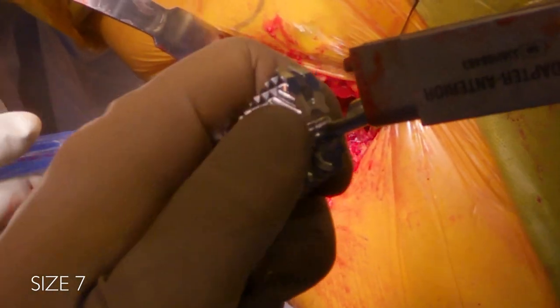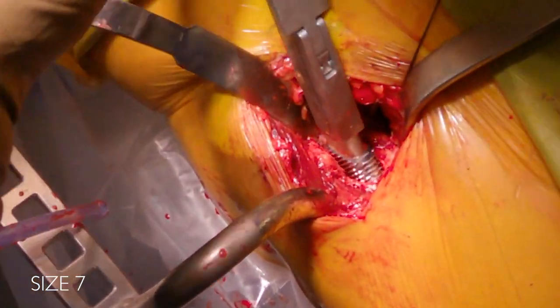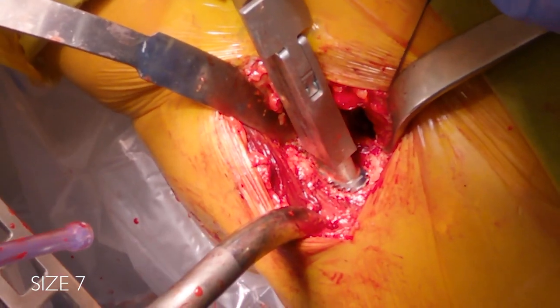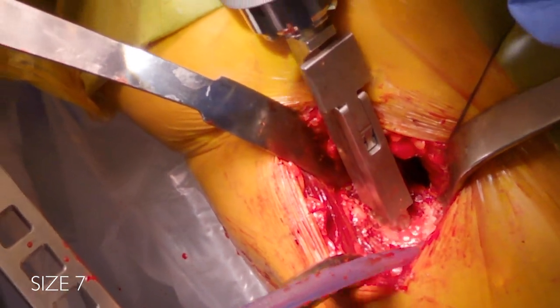Here's the size seven. You can see I'm not using my left hand at all — I'm essentially just using my right hand to pull the trigger. I jokingly say I broached the canal with my thumb; it's really effortlessly done.